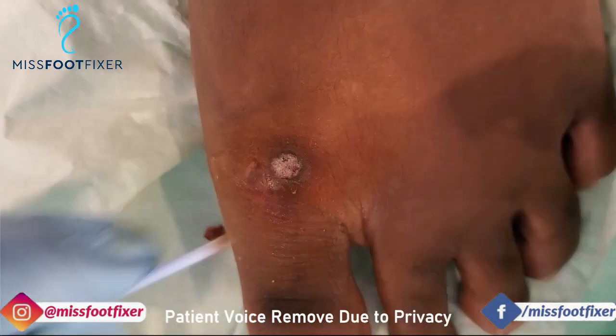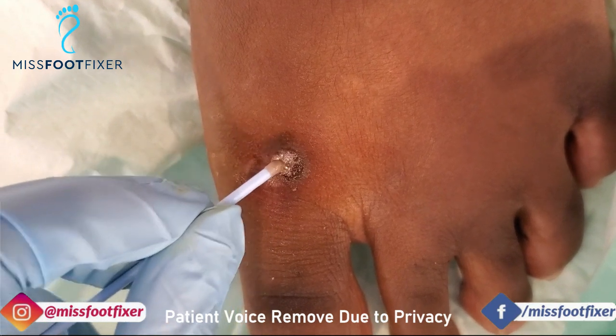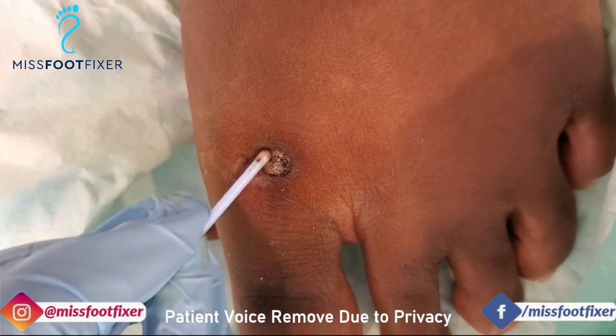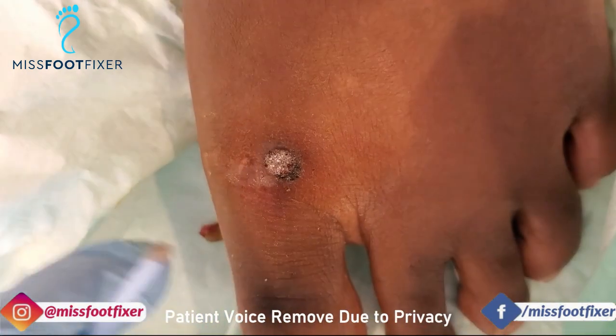Silver nitrate is good because it can treat the wart itself, but also it can stop bleeding, and allow us to see the field of where the wart tissue is a lot more easily.